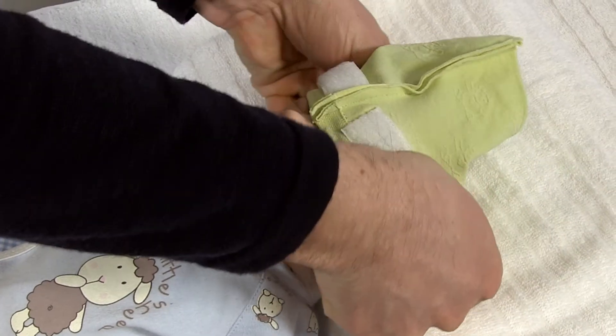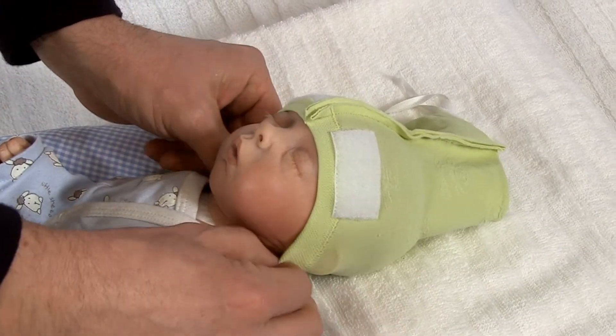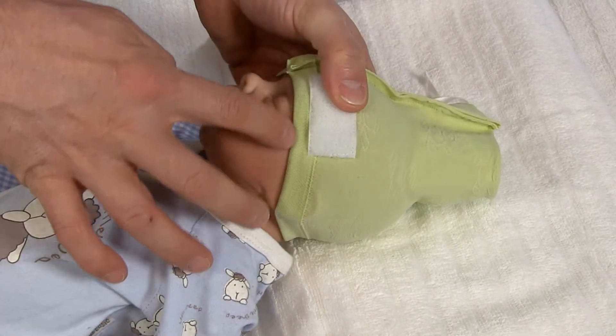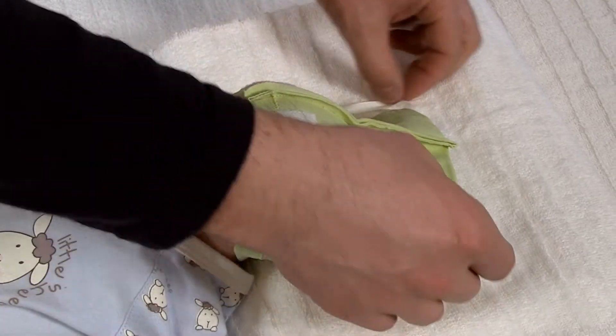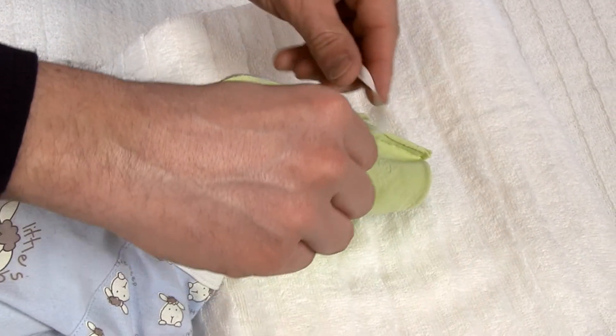Place the bonnet over the head of the baby. Make sure that the bonnet covers the ears and the nape of the neck. If no intravenous access to the head is required, gently close the bonnet with the attached ribbons so that it fits to the head.